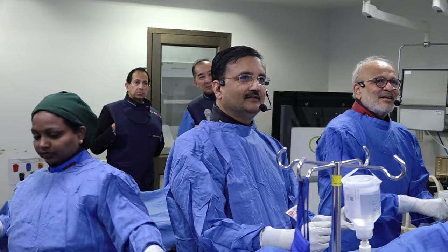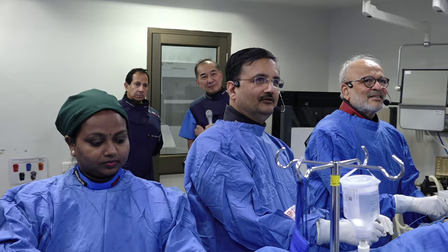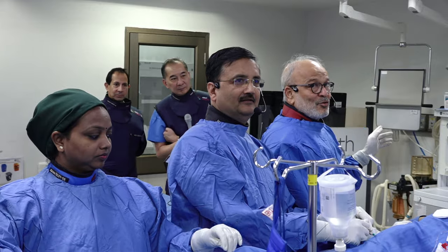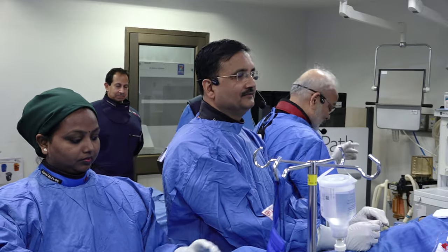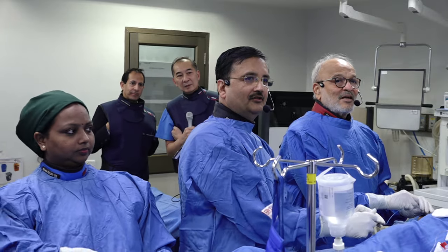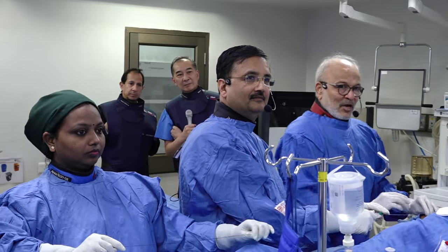See, this is the descending aorta. Go to RAO. Now I will not go to LAO. Go to RAO. Yes. Okay. And I am there. Okay, come to the AP view again.